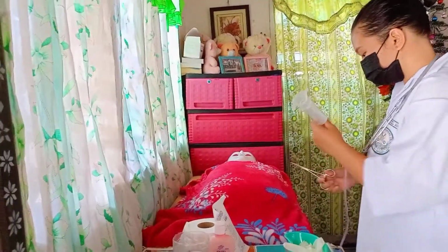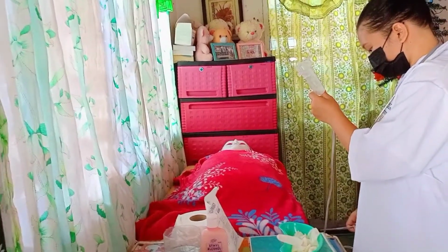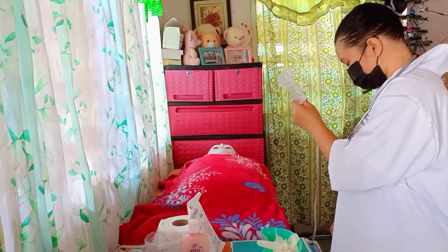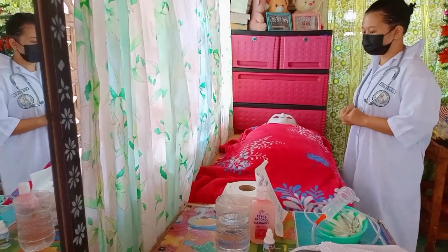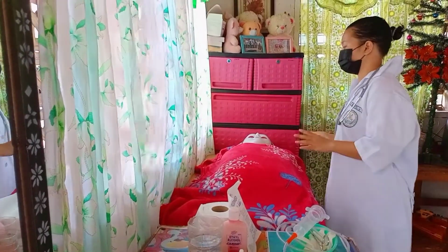The rationale of this is, the higher the solution container is above the rectum, the greater the force. For a high enema, hang the solution container about 30 to 45 cm, 12 to 18 inches. Next, identify the patient and explain the procedure to be done to ensure that you are performing the procedure to the right person.